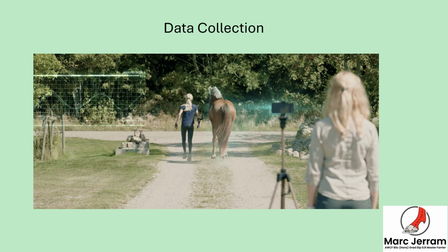Sometimes you may send the findings to the physio or to the vet or to the saddle fitter, depending on the asymmetry present. So that is a very useful part of this application, and that's something I use quite a lot really. But the fact this can be done in all kinds of weathers and all kinds of behaved horses, and can be done many times over without the aforementioned potential issues that could take place, is very beneficial to everybody involved.